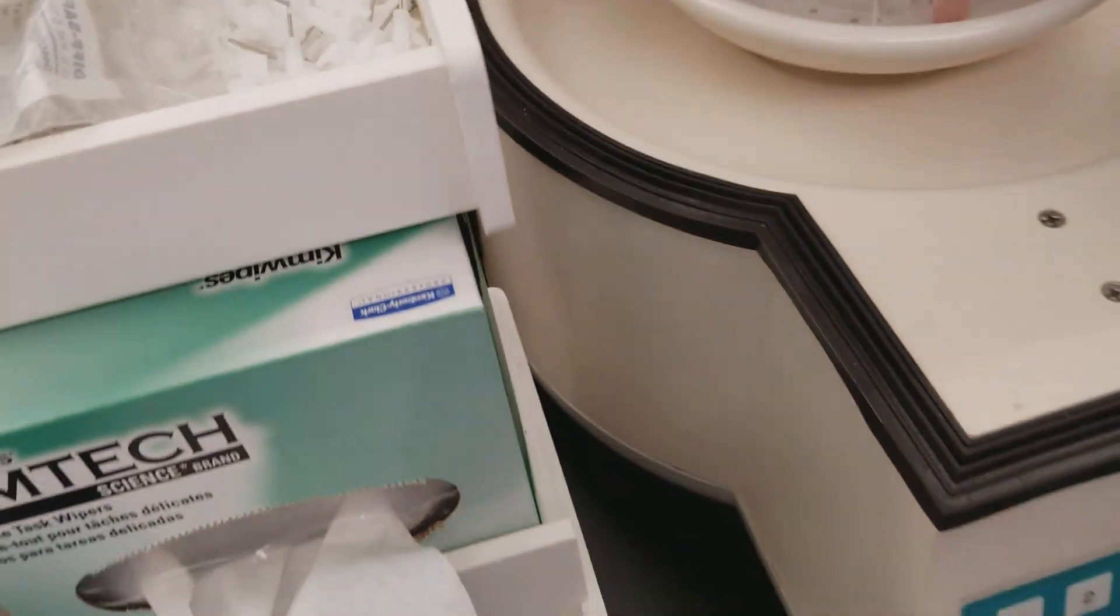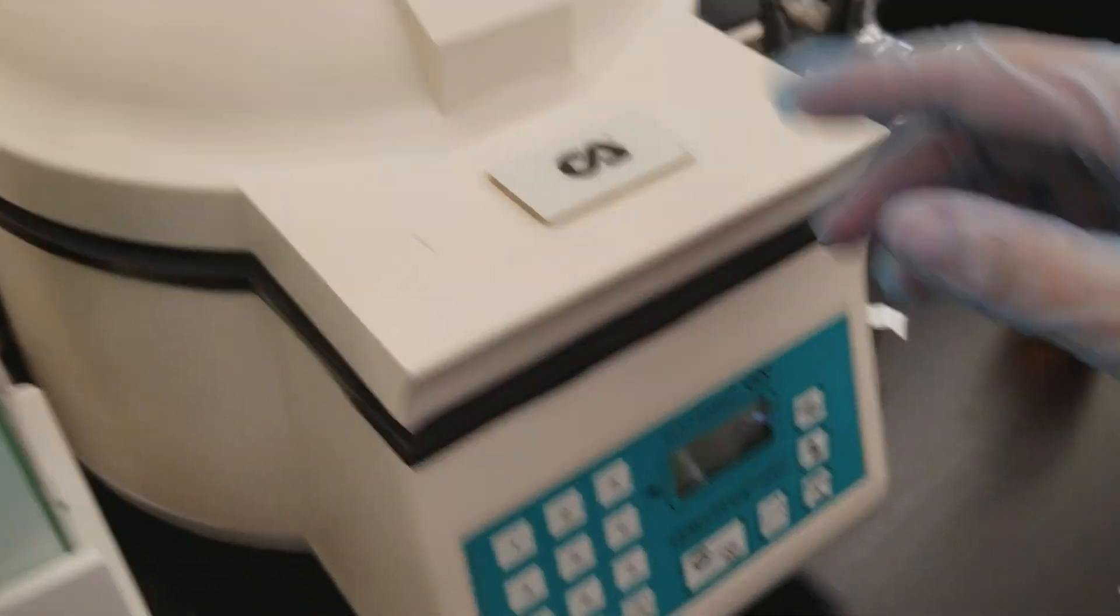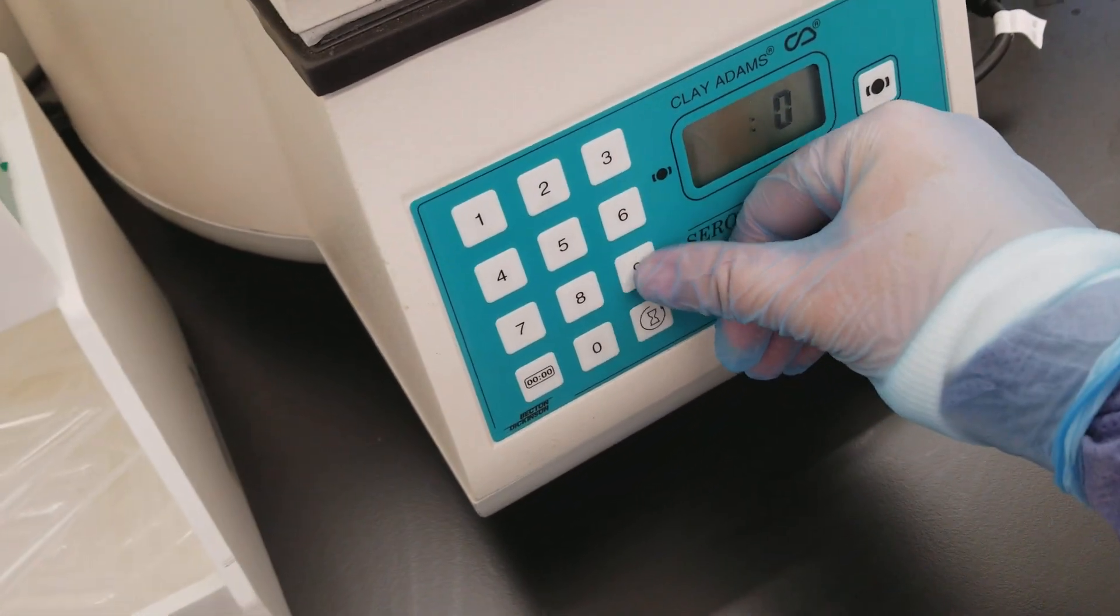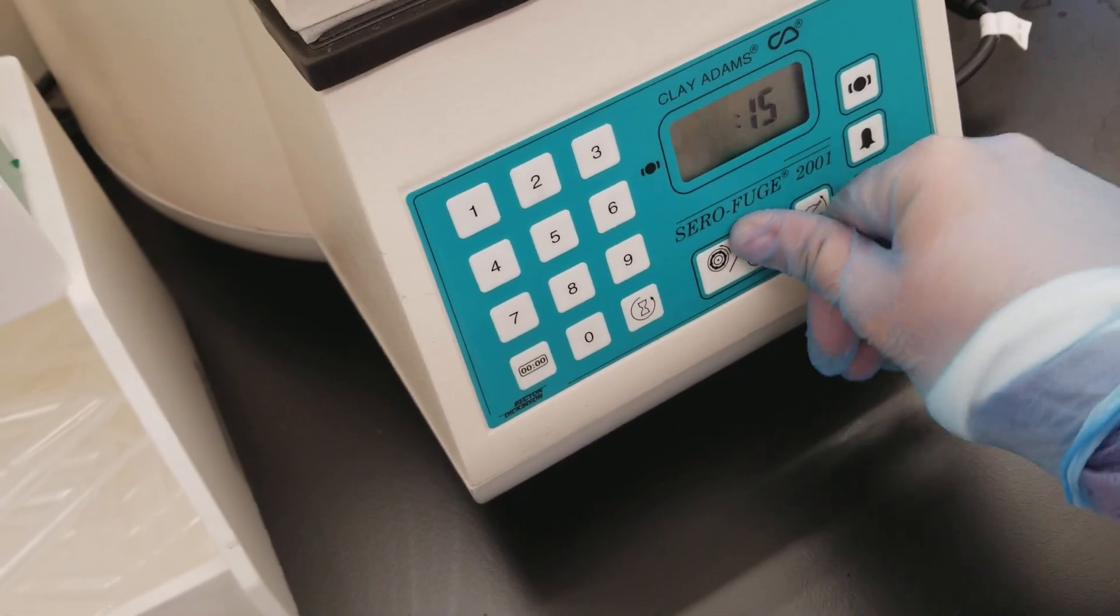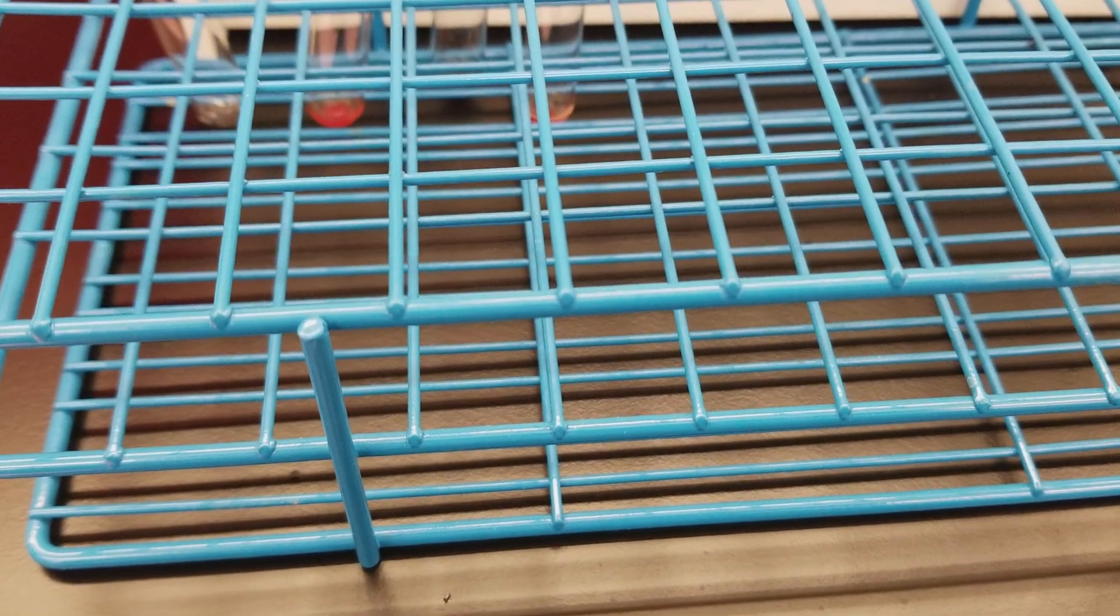So I have all of the tubes in there. I'm going to do the 15 seconds. So I'll do my three washes, dump them out in between each one and then decant all the way on the third wash. Then we'll move on to the next step.